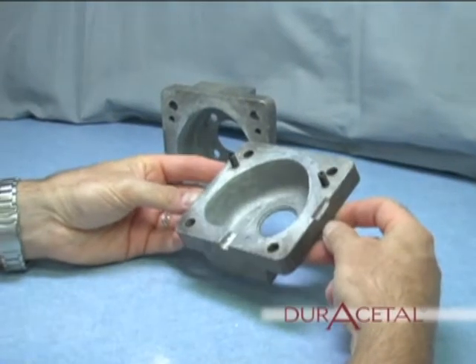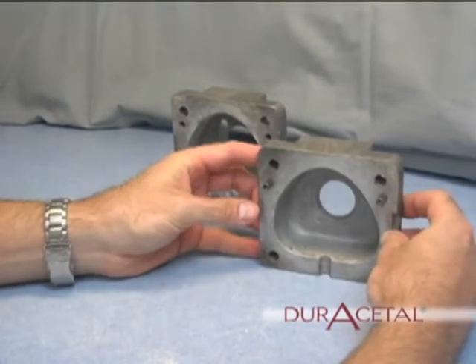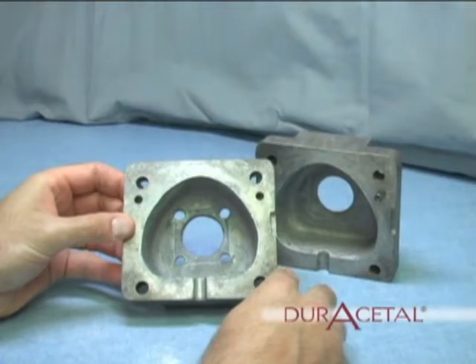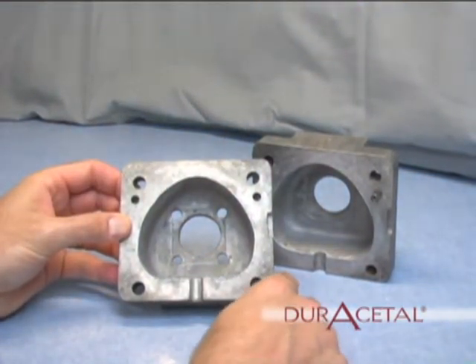Investing the case. The only difference between the two halves is the smaller holes in the top half. The holes allow air bubbles to escape. In the first step of the process, lubricate the two halves of the flask.